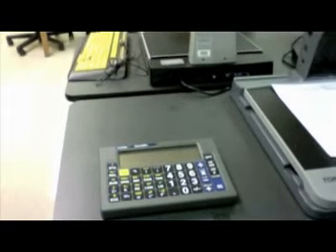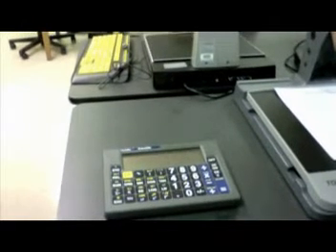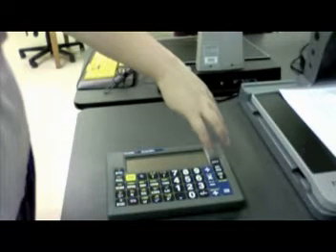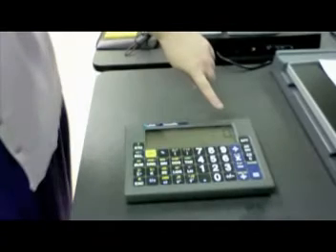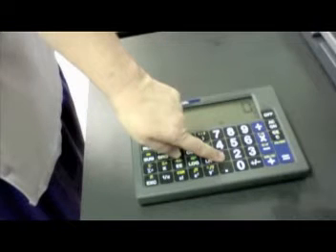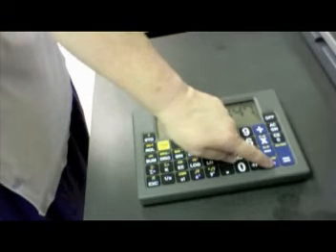Sometimes all you need is a device to be bigger. This is a portable large print calculator. So now your image on the display is considerably larger than it would be on your traditional one.